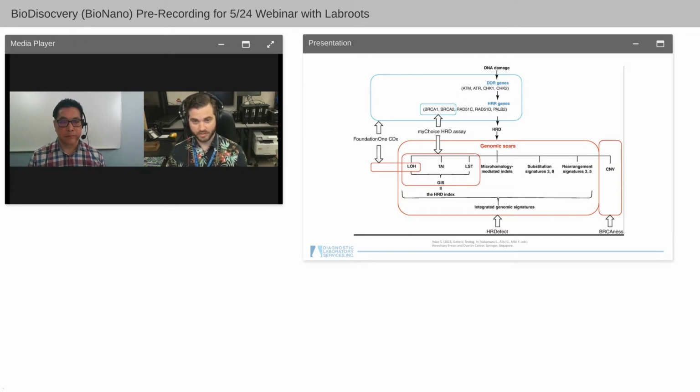They're also now leveraging, whereas down in the red, we see the genomic scar types present. These assays out here in the commercial space have next generation sequencing assays, and they both have two different approaches. You can see one is selecting for a genome-wide loss of heterozygosity evaluation.